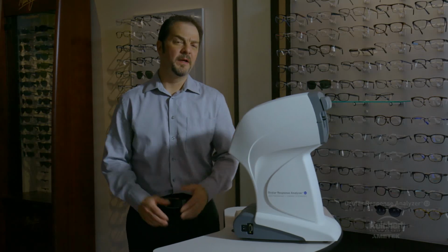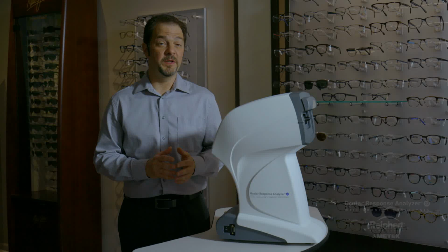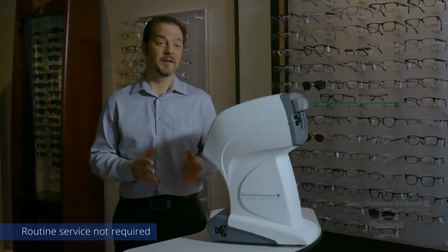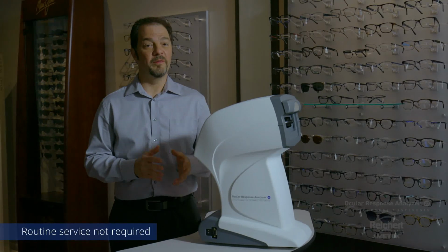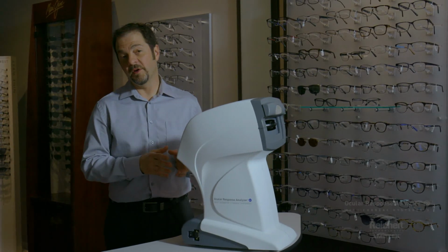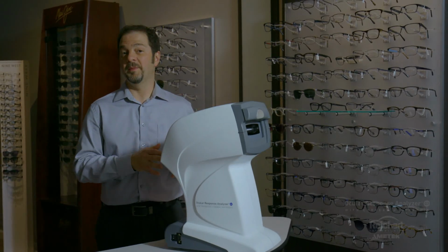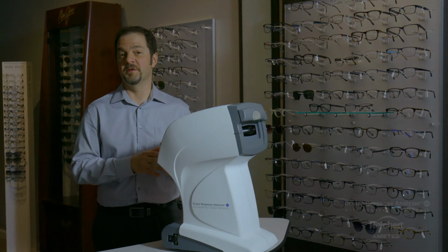Users often ask, does the ocular response analyzer require routine calibration or routine service? And the answer is no, not unless something goes wrong. However, the instrument does require routine cleaning. And as a matter of fact, every 30 days, a reminder will pop up on the screen saying, hey, you should clean some optical surfaces and the air tube on this instrument.